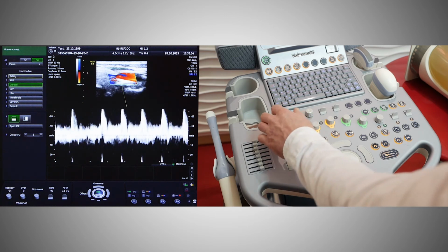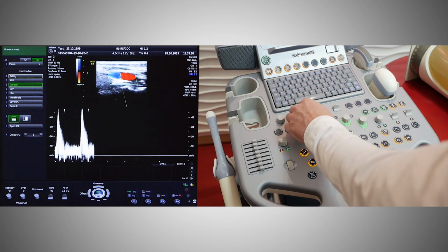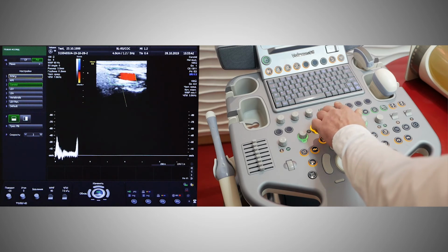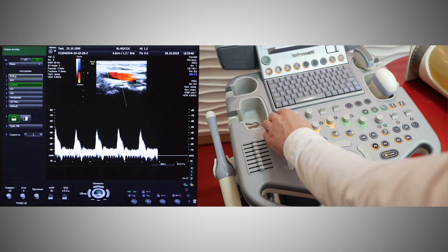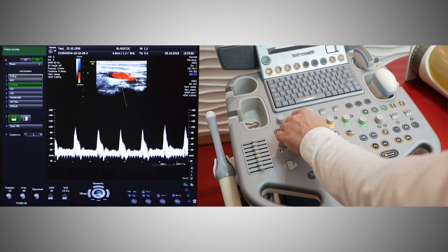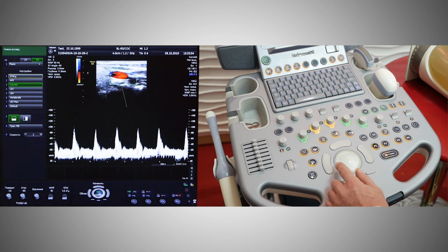That is a baseline, PRF button, and also Angle. When we press it, we get 60 degrees.